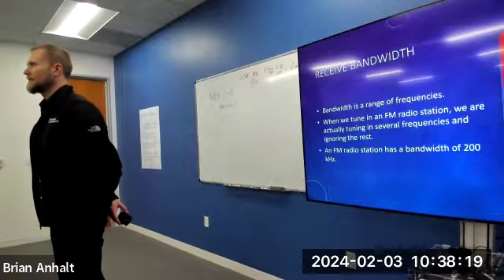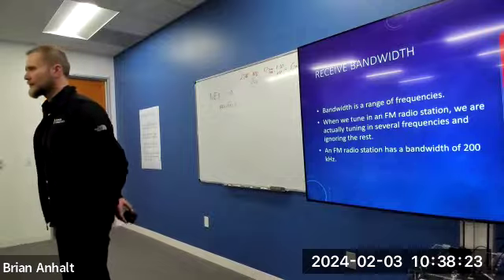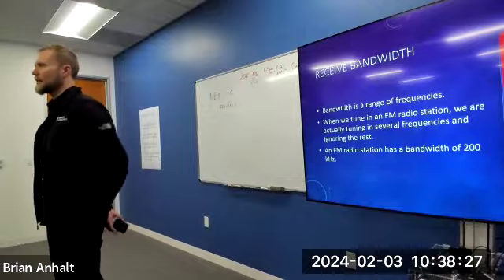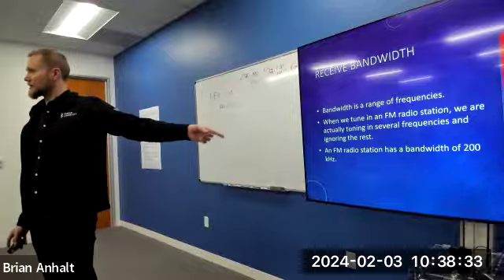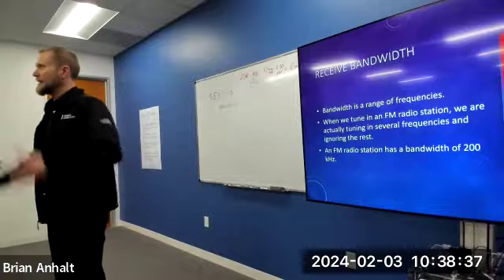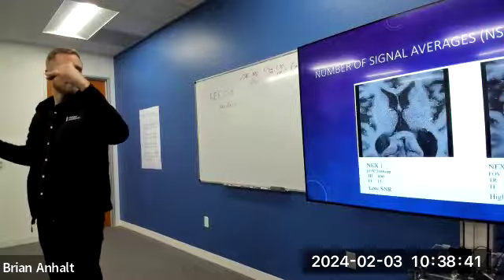Understanding NEX, kind of? So remember, K-space is where the raw data is collected. Raw data is our echoes. We sample echoes, we put them in K-space. How many rows of K-space do we need to collect? That's determined by our phase matrix, which we'll talk about, which is a resolution parameter. How many times do we fill each line of K-space? That's determined by what?